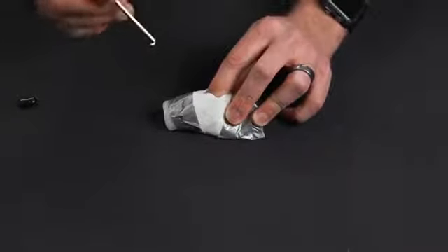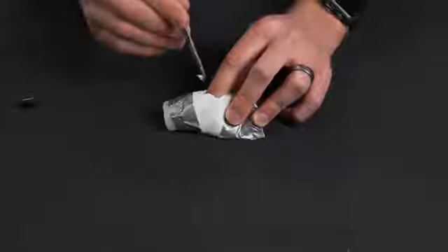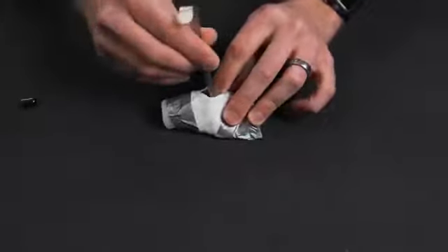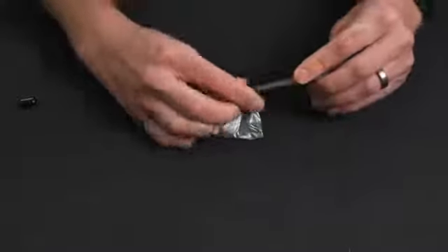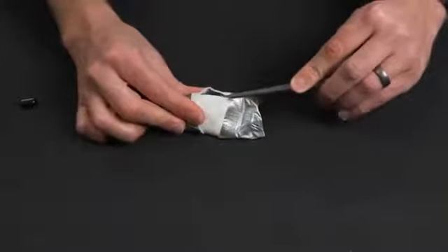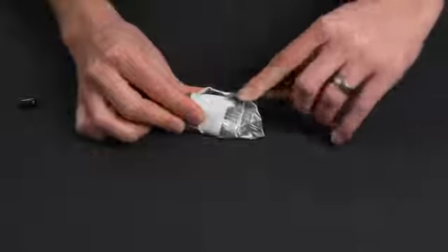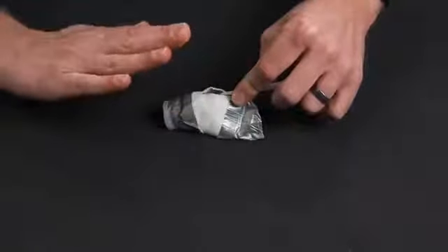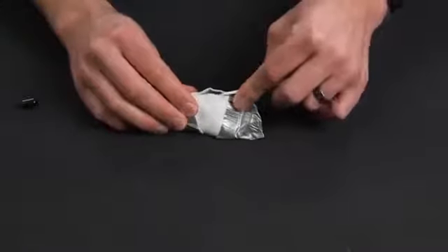I don't really care for that. What they'll teach you is to take the hook, point it away from your finger, place it in, take your finger out, and you actually grab the top and you can provide pressure up here. That's actually going to kind of extend this, and you're going to see the trachea come up in a real patient, make it easy to insert.